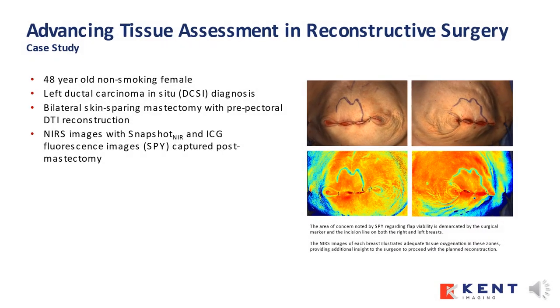In the case presented here, a 48-year-old non-smoking female diagnosed with left ductal carcinoma in situ underwent a bilateral skin-sparing mastectomy with a prepectoral direct-to-implant approach. Both SPY ICG fluorescent imaging and SnapshotNIR imaging were performed post-mastectomy.